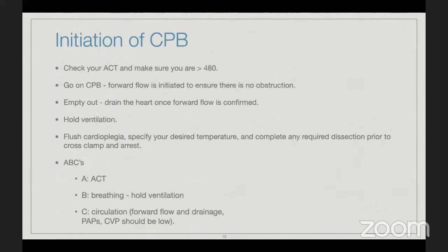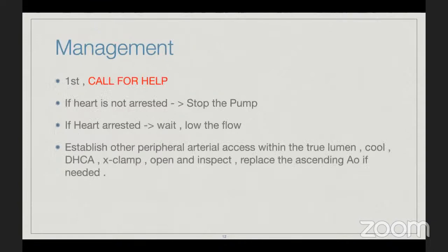So next, everything went smooth from cannulation. Just wait a second. Yes, doctor. So this is an important thing to have: don't panic. Very important. Dissection happened to lots of people. It's not the end of the world, though it is a catastrophic complication.